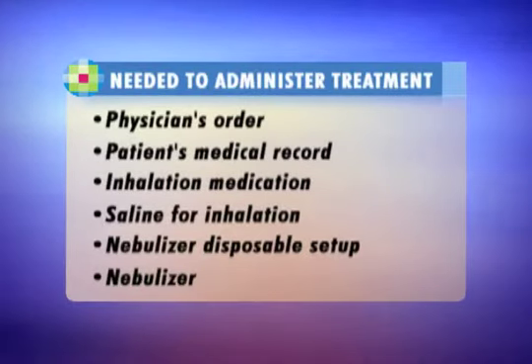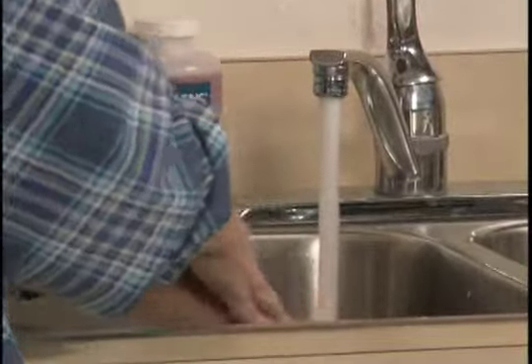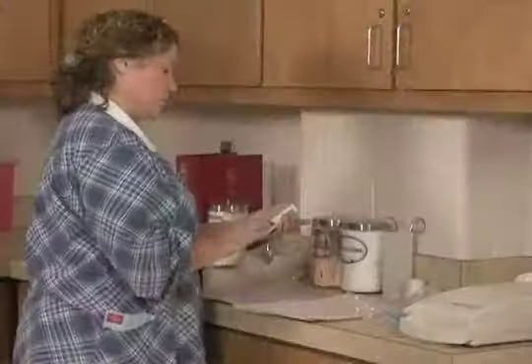In order to administer a nebulized breathing treatment, you will need a physician's order, the patient's medical record, inhalation medication, saline for inhalation, a nebulizer disposable setup, and a nebulizer. Before you begin the treatment, wash your hands. Assemble the equipment and medication.